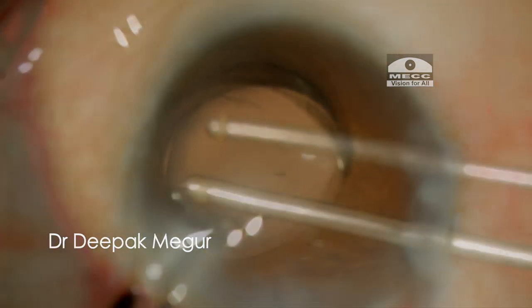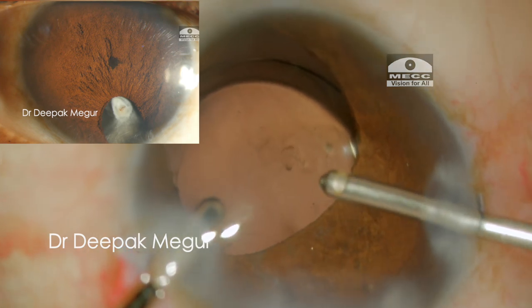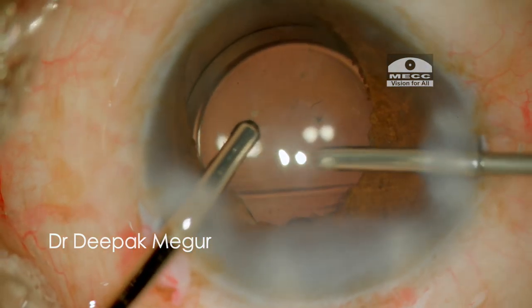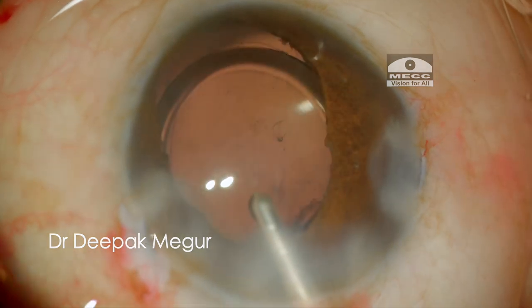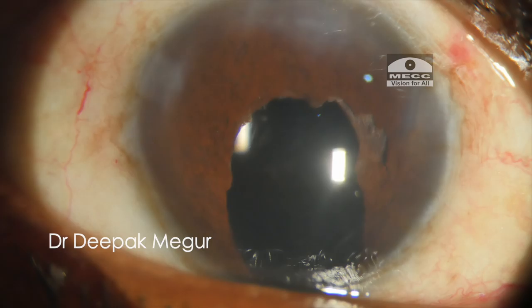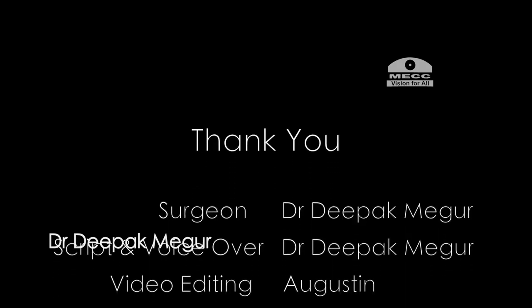Before closing off, I thought I'd take care of the eccentric pupil which was excessively downward drawn. So I'm using my cutter to trim the superior margin of the pupil to minimize this downward drawn pupil. Finally, the job is done — and indeed it was quite a long case. The next day, as expected, the cornea was slightly edematous, but eventually it does clear off, and this is how the eye looks at the third postoperative day. Thank you for your attention and I hope this helps.